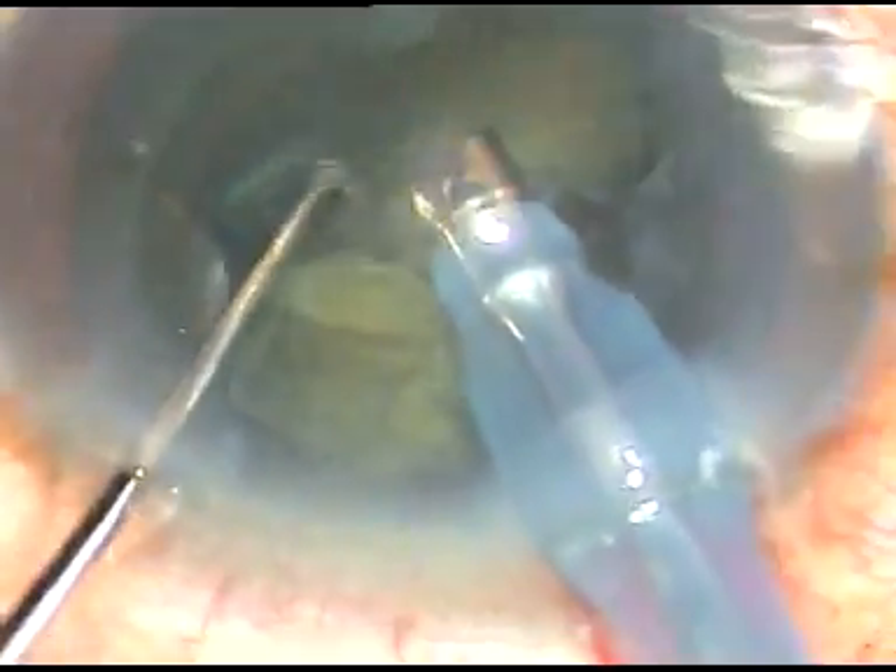One half of the nucleus has been removed. This is the other half. In this case, FACO energy was used — minimal FACO energy was required. FACO energy was about 55%, flow rate was 45, and vacuum is 450. This is thick epinucleus.